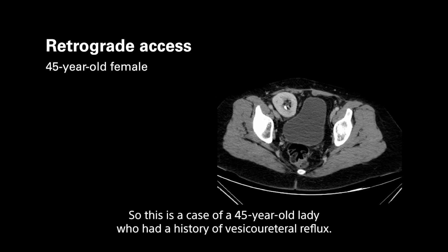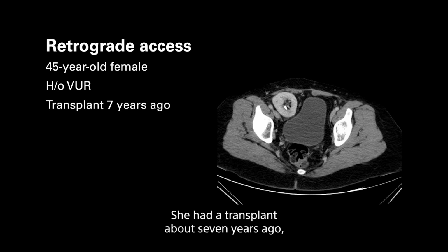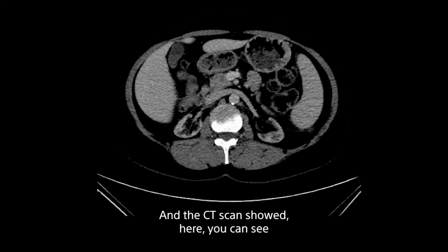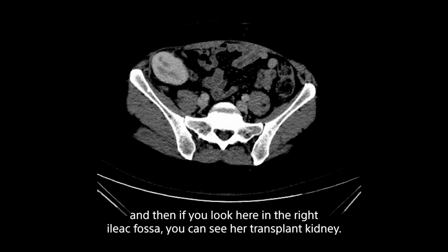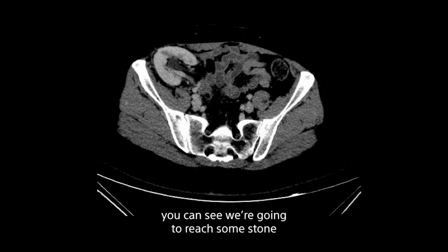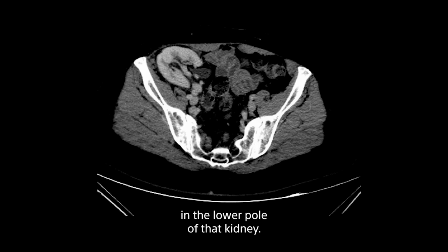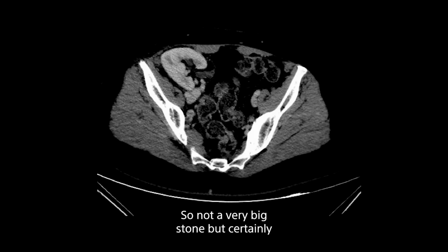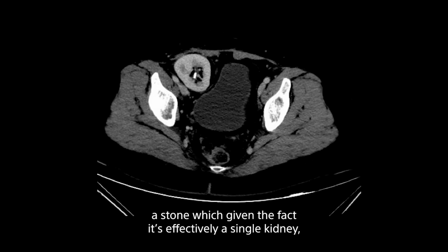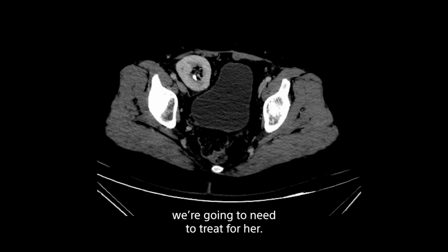So this is a case of a 45-year-old lady who had a history of vesicoureteric reflux. She had a transplant about 7 years ago, and she had a CT scan follow-up for an unrelated complaint. And the CT scan showed, here you can see the native kidneys which look atrophic, and then if you look here in the right iliac fossa, you can see her transplant kidney. And as we follow it down in the transplant kidney, you can see we're going to reach some stone in the lower pole of that kidney. So not a very big stone, but certainly a stone which, given the fact it's effectively a single kidney, we're going to need to treat for her.